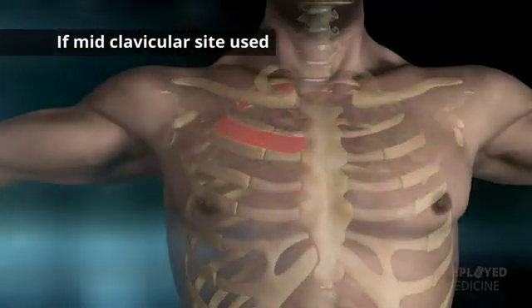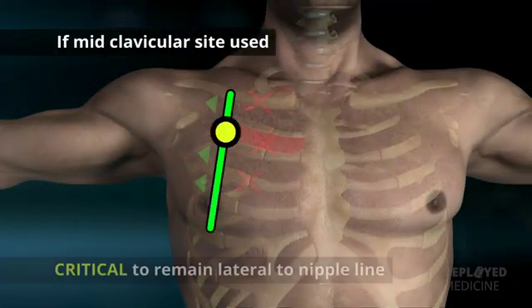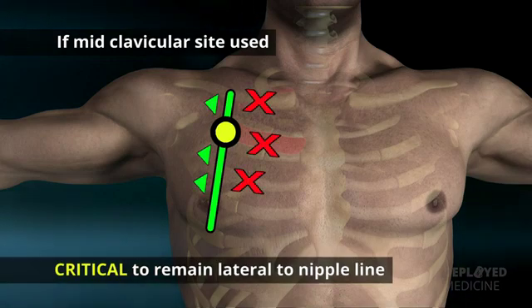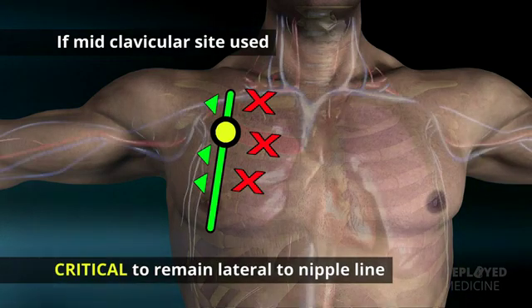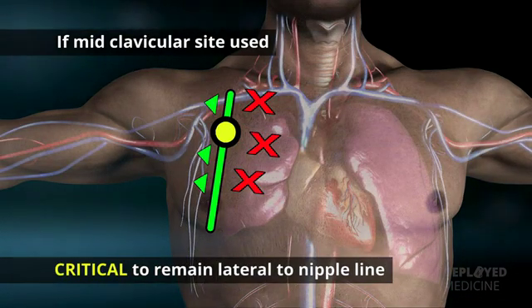If the anterior MCL site is used, it is critical to remain lateral of the nipple line to avoid the heart and large blood vessels.